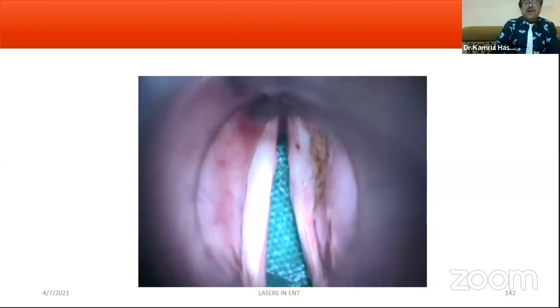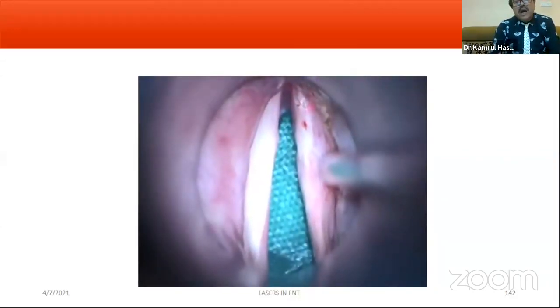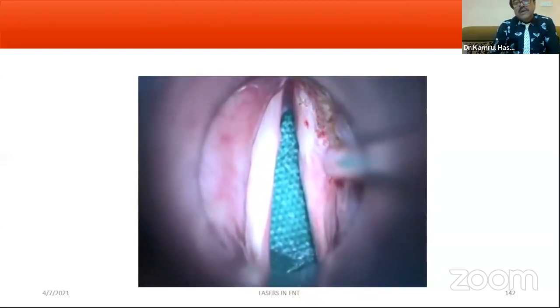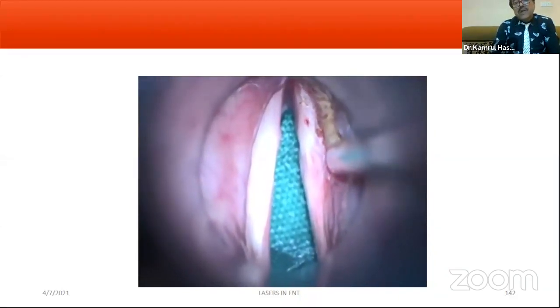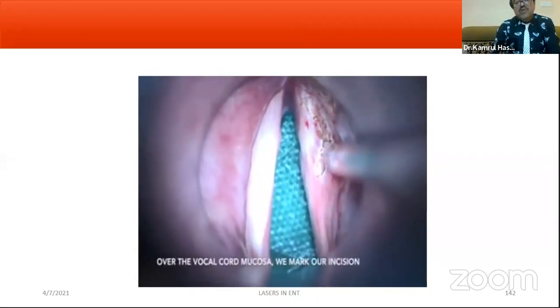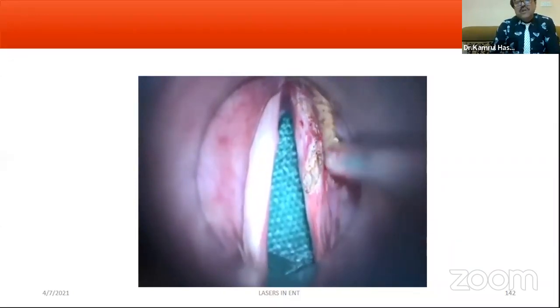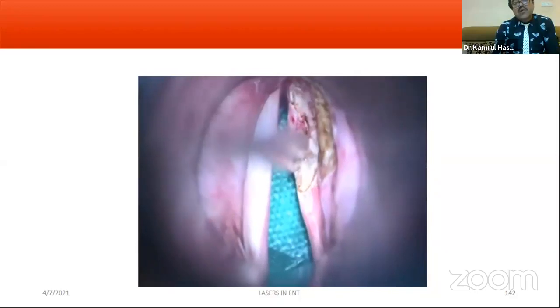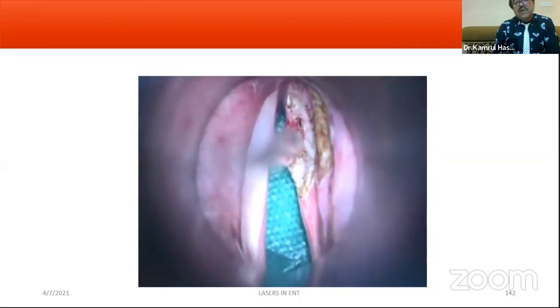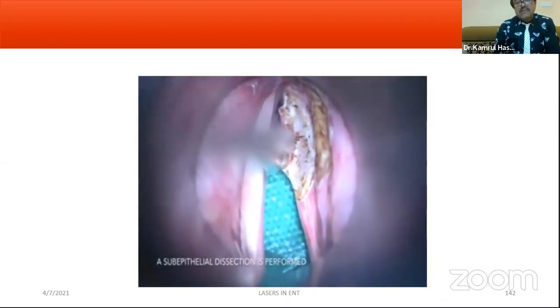So our new generation should be acquainted with how to use the carbon dioxide laser and what precautions to take. Before using the laser, one should be equipped with the primary, normal surgery. For tonsillectomy, they should know the dissection method, which is still the best method. Laser, diathermy or coblation are all armamentarium, not alternatives.